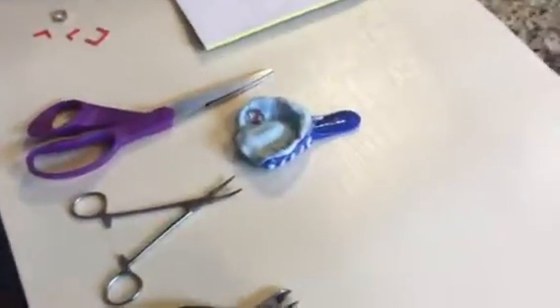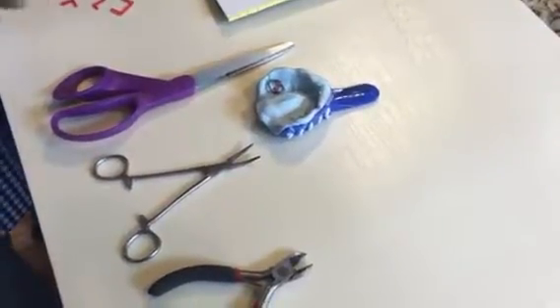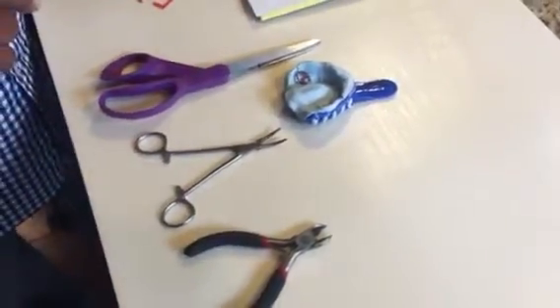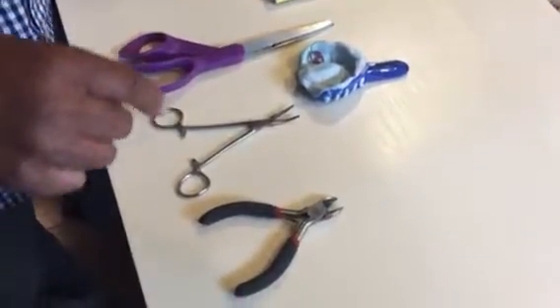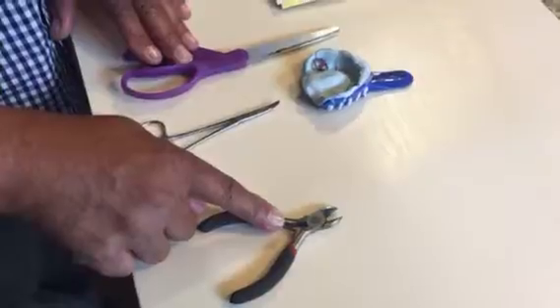With this particular device, we have avoided those particular procedures in order to make it very convenient and easy for you to get this job done. The tools that you will need to achieve the proper seating of the Dballock are one pair of hemostats, one pair of scissors, or one pair of diagonal cutters.